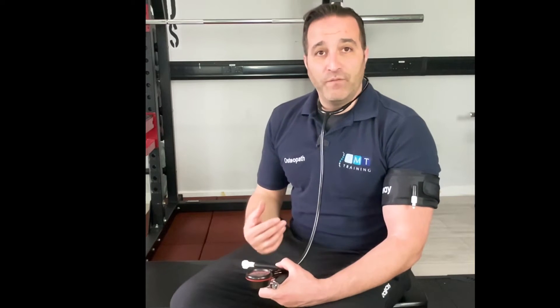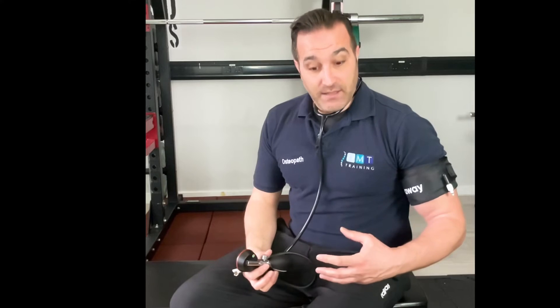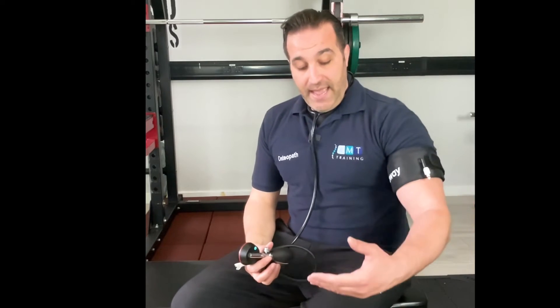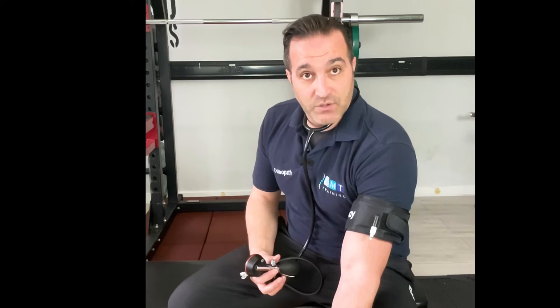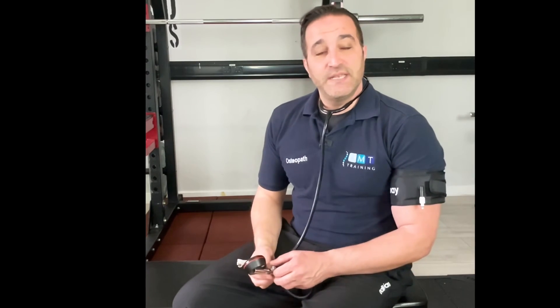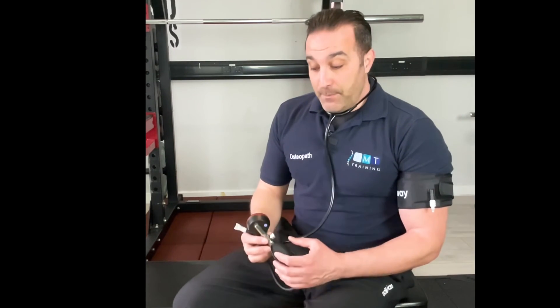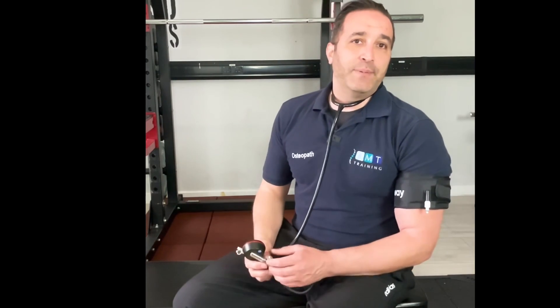For the lower limb, you'll be looking at somewhere around 60 to 80 percent of limb occlusion pressure. The way to measure that would be looking at the popliteal pulse, or coming down to the foot and the ankle pulse, or the dorsal pedal artery pulse. Please remember to look at the safety aspects of where you're placing the cuff, as this obviously makes a significant difference. Using the air cuffs is fantastic in a clinical rehabilitation setting.